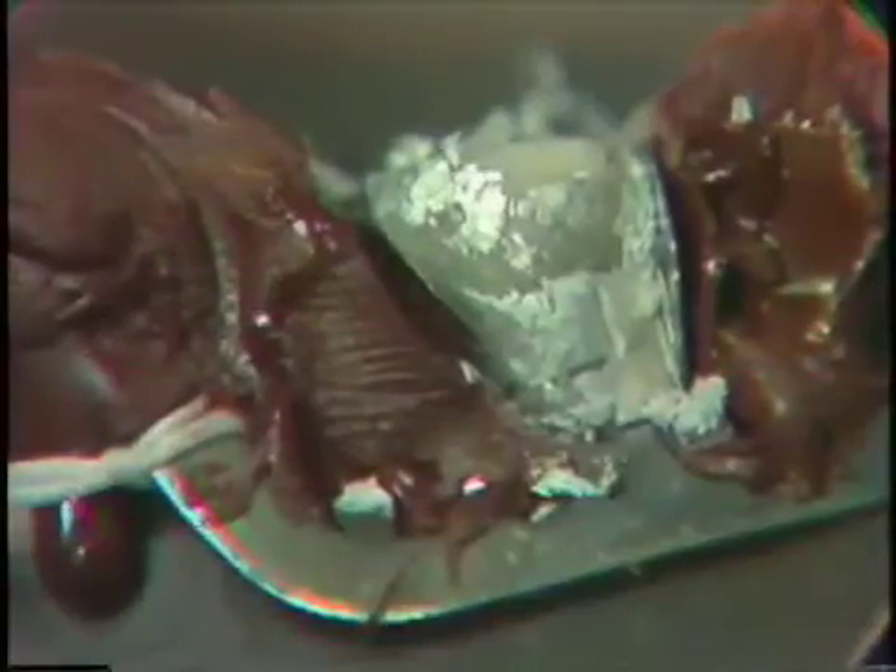Now we've condensed our amalgam and we will commence with our carving just as we did in the other situation, cutting down back into the interdental area with the point of the instrument against the amalgam matrix, cutting the amalgam back to the cavity preparation. Now we're going to have to get our matrix off in here, so you must work quickly.